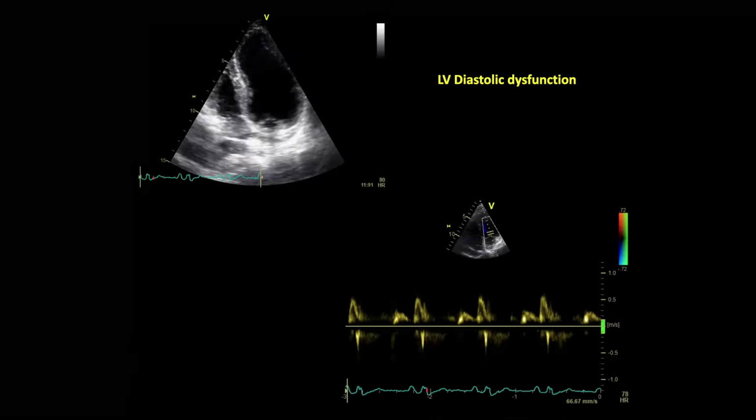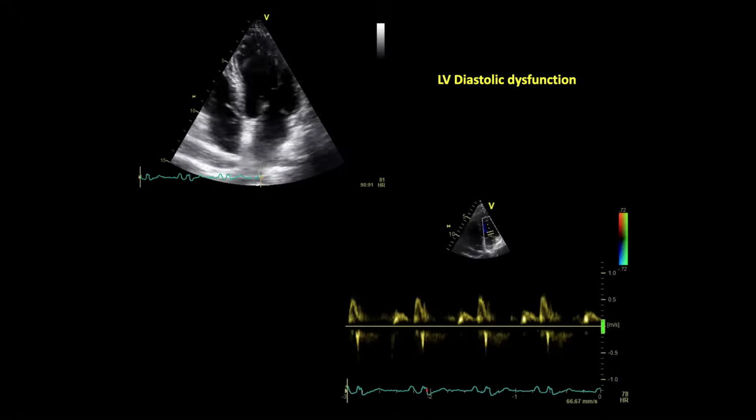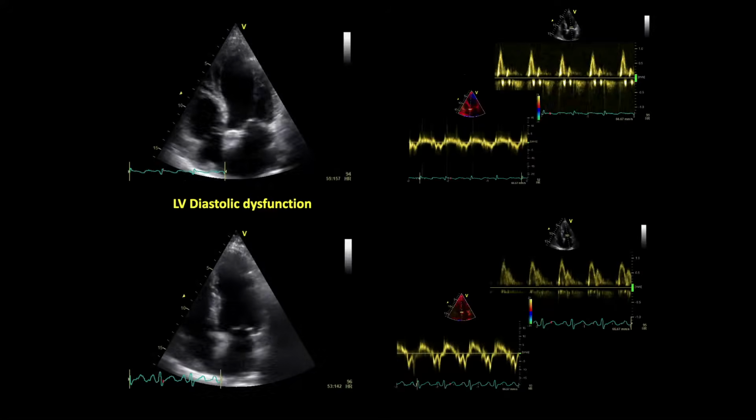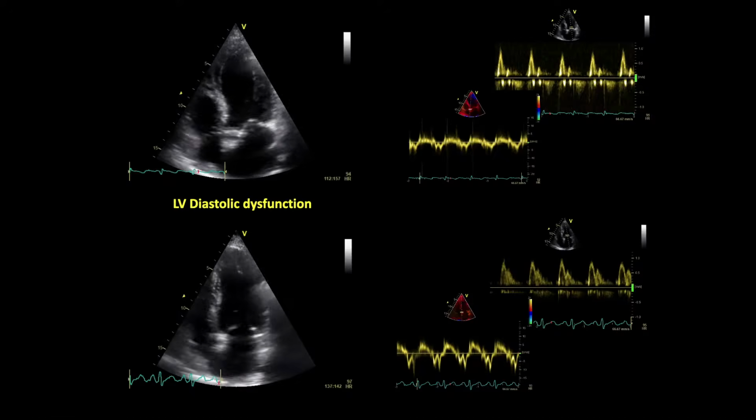And also a lot of importance for diastolic dysfunction. Anytime you have CAD, whatever the type, acute or chronic, look at the diastolic dysfunction. Here you have a grade 1, so that means this patient is going to do well. But when you have a CAD patient with grade 2 or grade 3, that means this patient will have more events and a lot of problems.